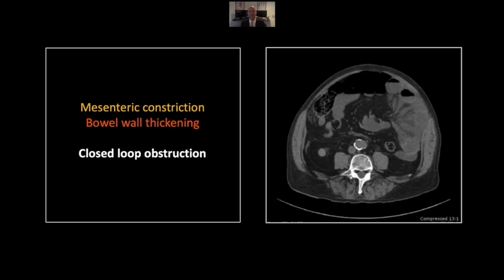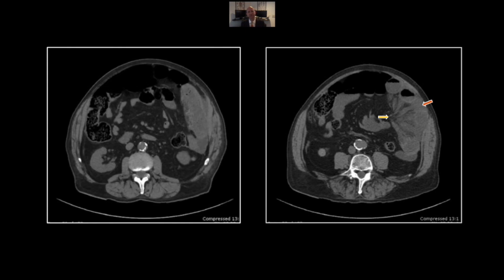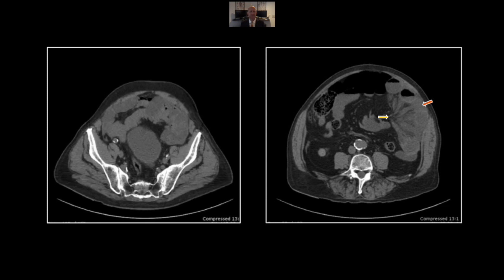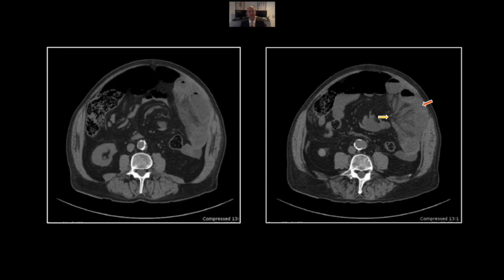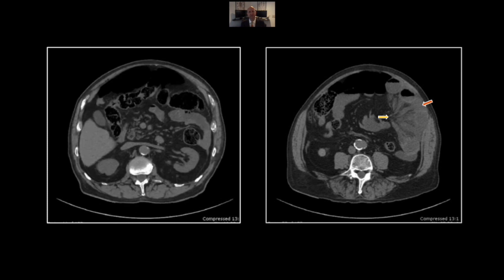Our next case is a closed loop obstruction — a surgical emergency and a particular type of obstruction very worth noting specifically. There is extensive mesenteric stranding as well as a central point of convergence of the mesenteric vessels and stranded mesentery. There is bowel wall thickening in a peculiar distribution: the bowel always appears to be accordioned together, stacked one on top of another, all converging to a central point around which it is twisted. You can see that stacked appearance of these very turgid small bowel loops. That is a classic appearance of a closed loop obstruction — again, a surgical emergency.